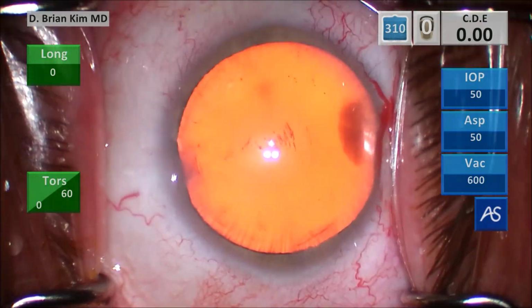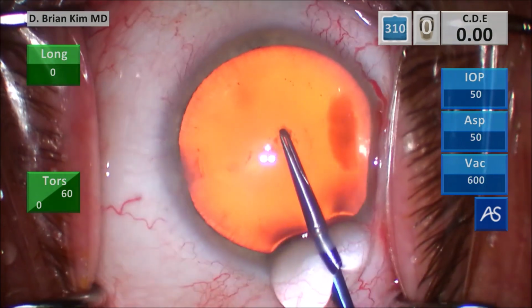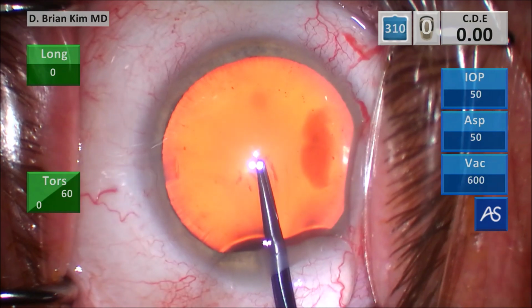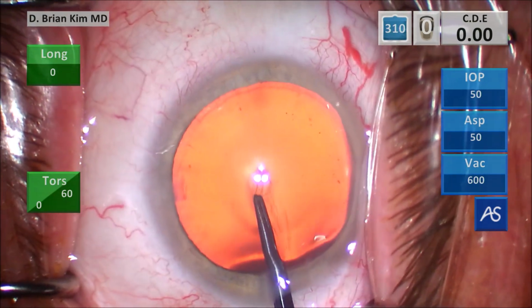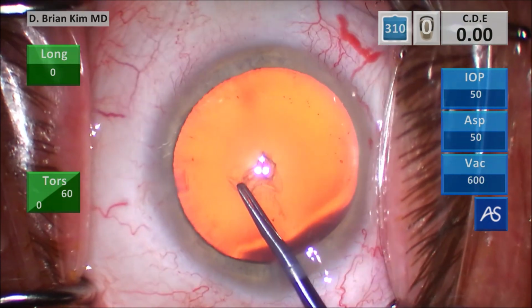This is the Hardten-Perkar sharp tip forceps to go in sideways. And then I puncture the center. The tear went a little bit towards the left. Go ahead and grab the tear.